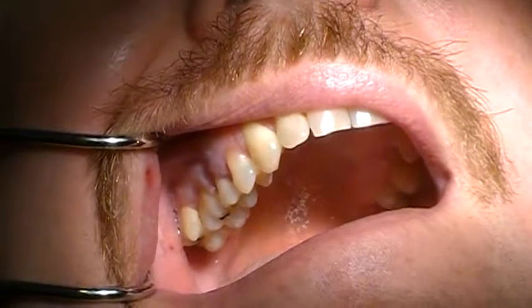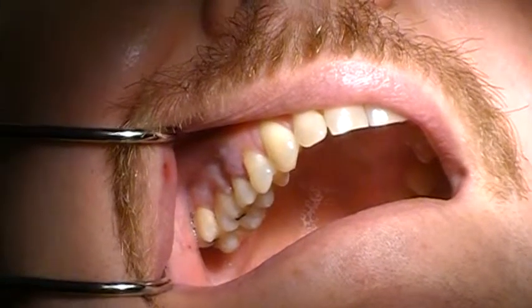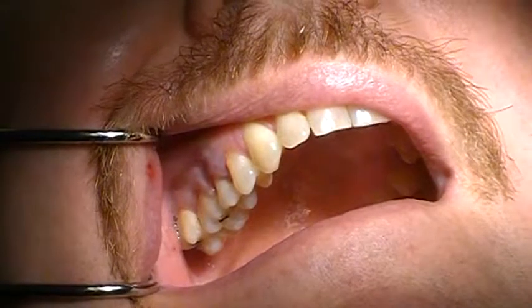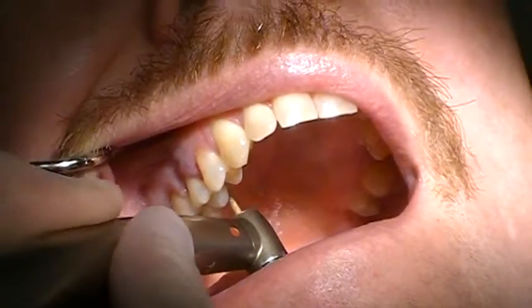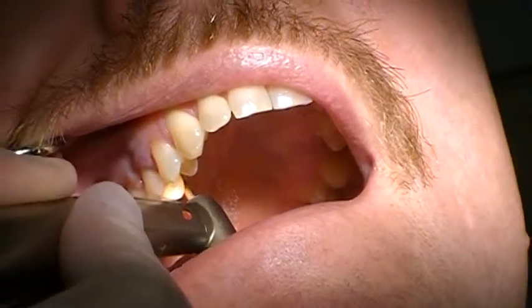The maxillary right second bicuspid has significant inflammation. So prior to extraction, I'm going to flatten out the palatal root structure a little bit. I'm just using a high speed — open big for me, sir — and I'm going to flatten the root structure about five to six millimeters on the palatal.